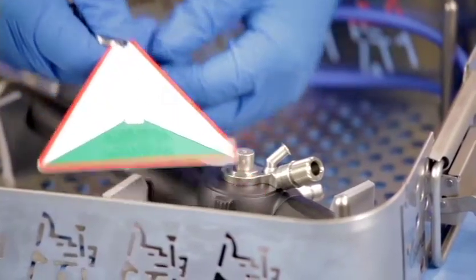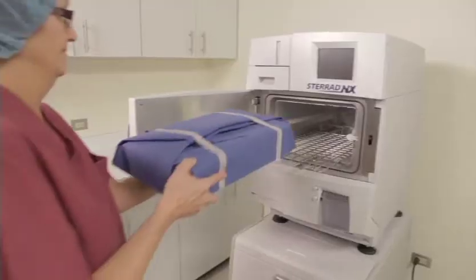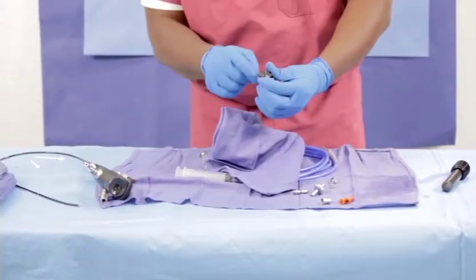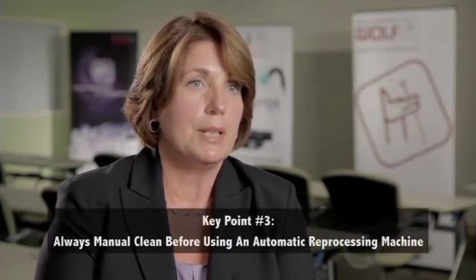After machine reprocessing, the endoscope is ready for patient care, storage, or low-temperature sterilization. Make sure all ancillary pieces are with the scope — the endoscope will not be usable without them. Having both a manual pre-clean and an automated machine programmed to perform the same steps each time, instilling the same detergents and chemicals, will definitely improve the quality of reprocessing for an endoscope.